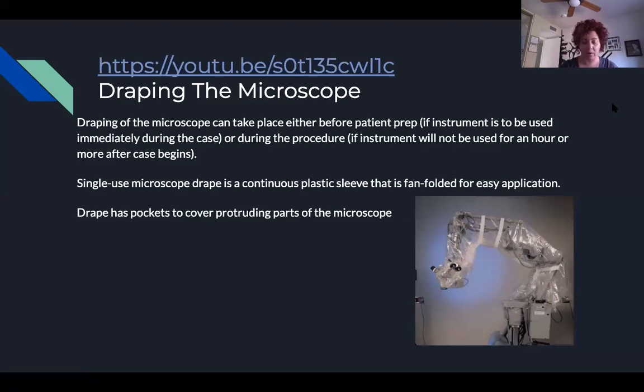And at that point, everything ceases and you move back or you do whatever you have to do so that the anesthesiologist can essentially get underneath those drapes, take out the LMA, and intubate the patient. You might even be holding up your drape like this while they're doing it. So there are situations where they do need to get in there and get to it. And if that's the case, then we're going to make a hole, make a space for them to do that.